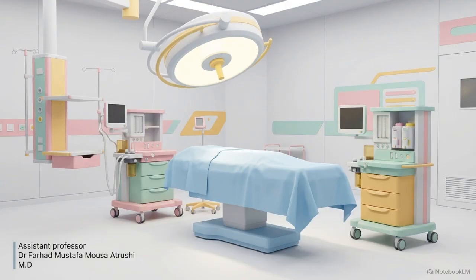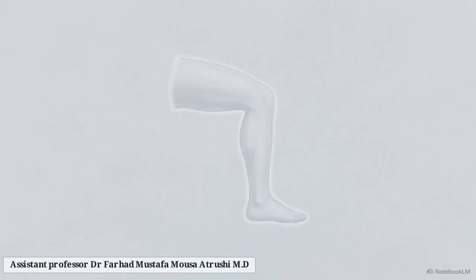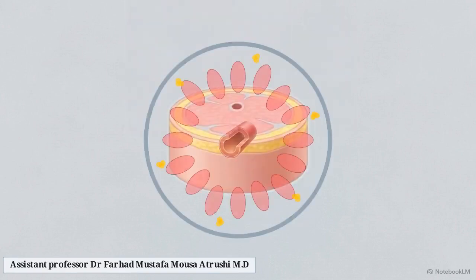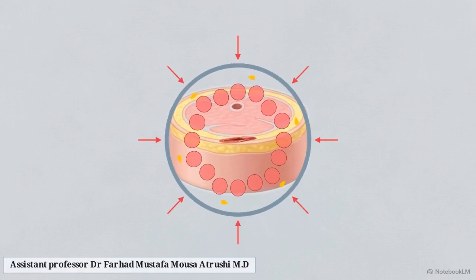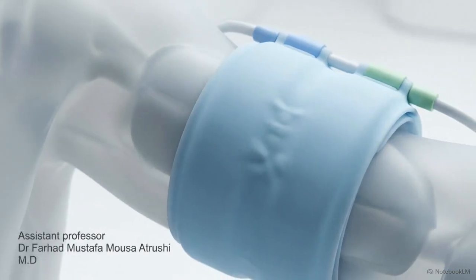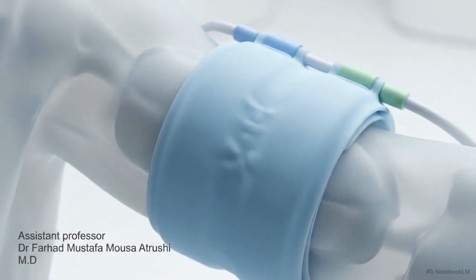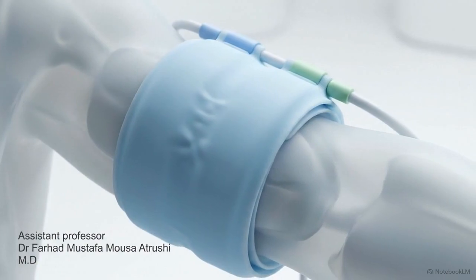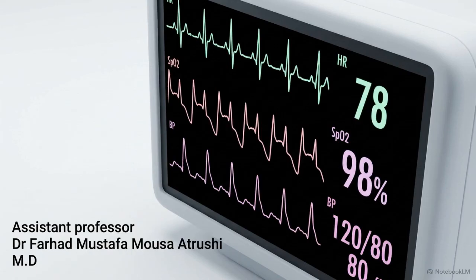And today, we are evaluating the mechanics of blood flow control in the operating room. Our primary objective is to define a precise protocol for achieving total surgical hemostasis while avoiding the application of unnecessary pneumatic pressure to the patient's limb. Relying on standardized static pressure settings often leads to incomplete occlusion or avoidable soft tissue and nerve damage. Modern surgical practice necessitates personalized hemodynamic adjustments.